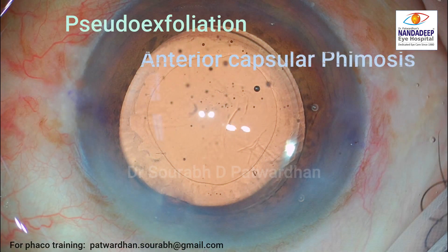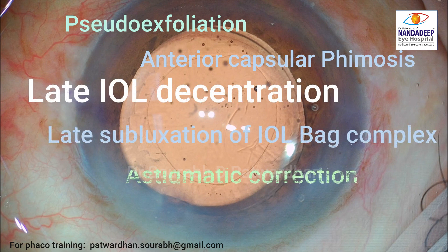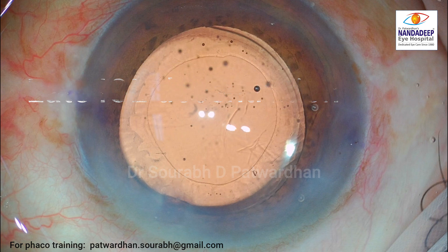This is a case of pseudo exfoliation. There are higher chances of anterior capsular phimosis, late IOL decentration, late subluxation of the IOL-bag complex, and also the patient has some astigmatism which may need correction.